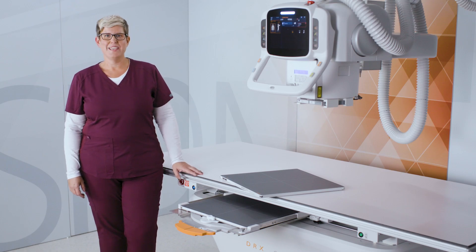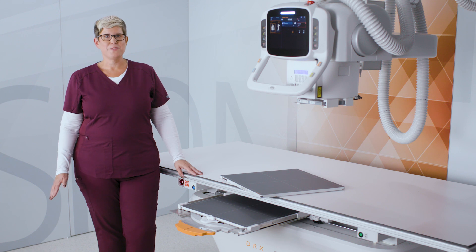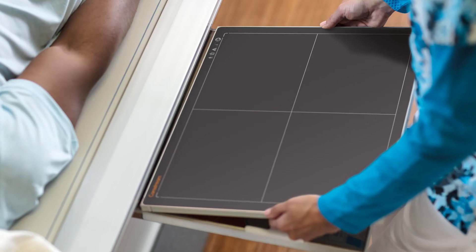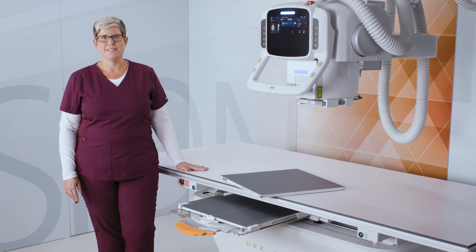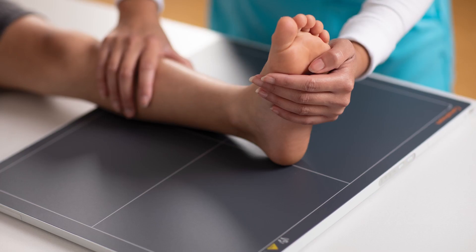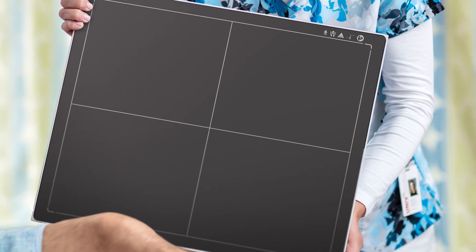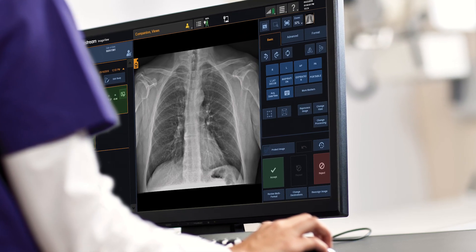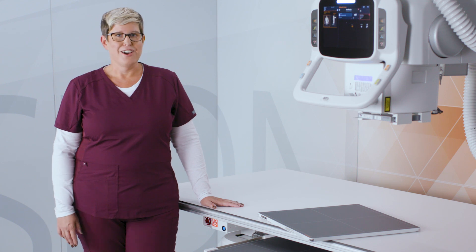Our Focus detectors are new to the CareStream family and are our most affordable wireless DR detector. When paired with ImageSuite software, it provides a retrofit solution for facilities that are currently using film or CR to upgrade to wireless DR technology. This eliminates the price barriers of purchasing a full DR system, as the detectors fit into the existing table and wall stand buckies. The Focus detector comes in two different sizes. Its wireless design allows for easier positioning and eliminates trip hazards. The Focus detectors use cesium scintillators to help reduce dose while maintaining image quality. Stepping up to full digital x-ray is a tremendous way to speed your workflow, increase productivity, and support a higher standard of care. The Focus detectors provide the budget-friendly way to upgrade to DR imaging technology.